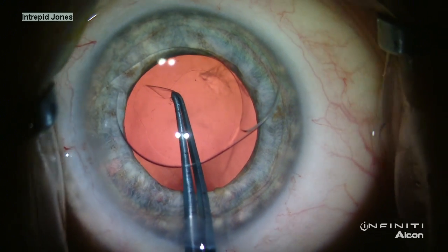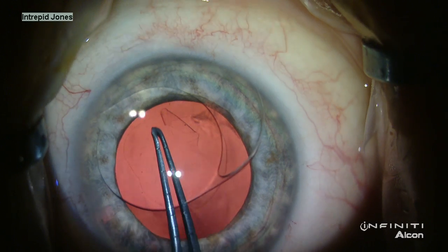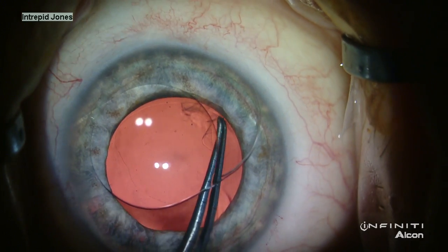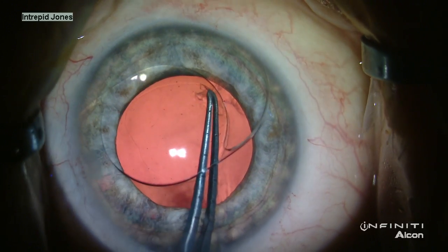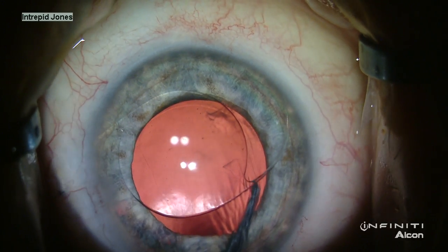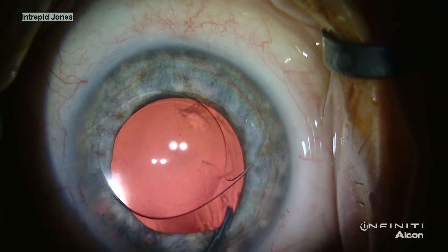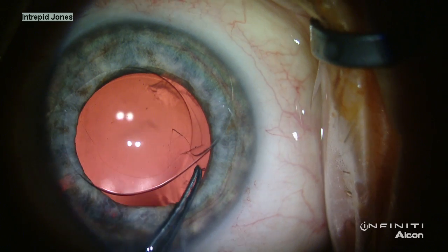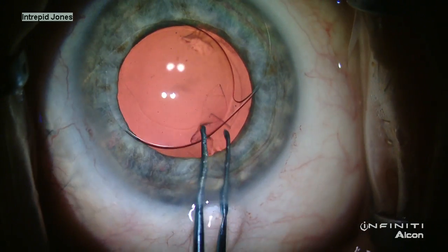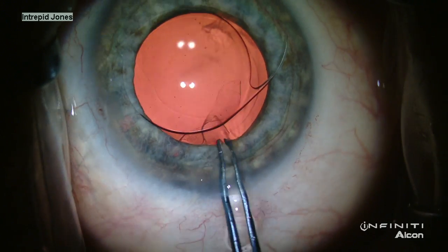With such a small and de-centered capsulorhexis, it was difficult to place the lens into the capsular bag at this point, so with a snip of the edge, I enlarged this capsulotomy to accommodate the lens more easily. As the original capsulotomy was de-centered, an asymmetric enlargement was needed, and in the thinner area of the tear, it was helpful to grasp more closely to the edge of the tear.